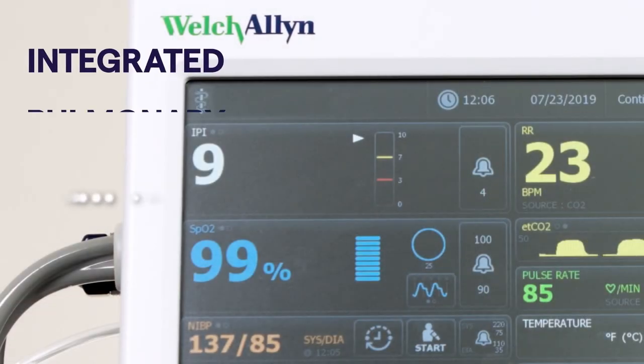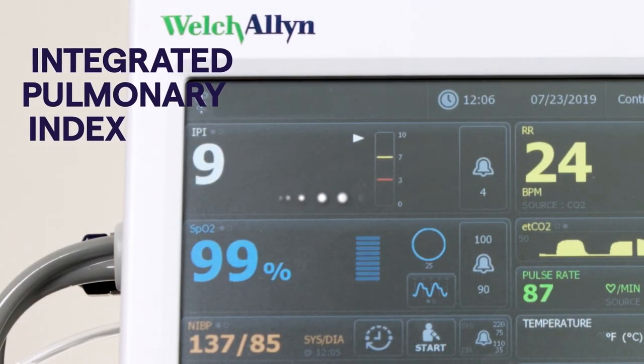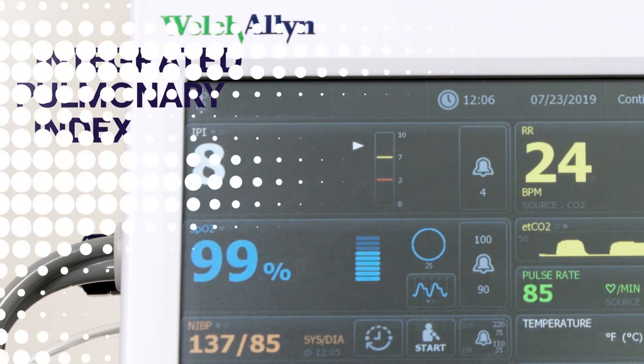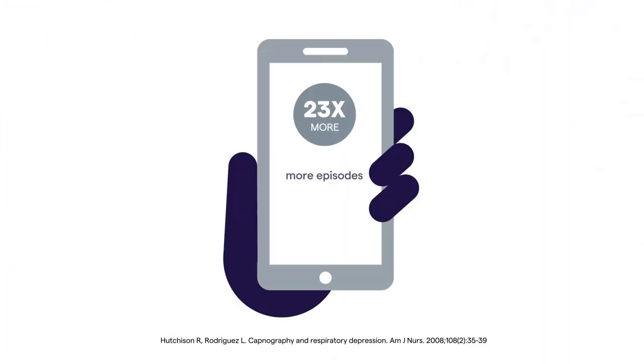It also features an integrated pulmonary index to help caregivers assess respiratory status quickly and easily. With the Connex Vital Signs Monitor, Sarah is able to continuously monitor Michael's CO2 at the airway during his stay, enabling her to intervene early if needed to help prevent patient deterioration.